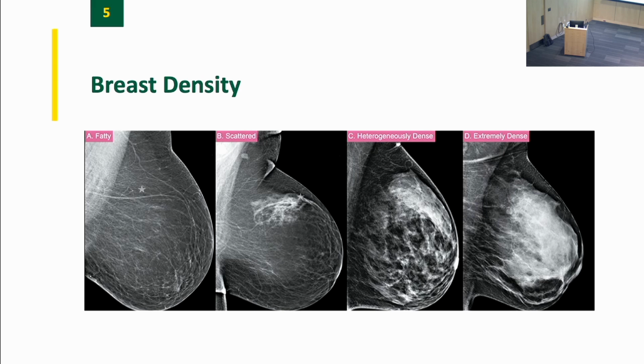There are 4 densities in X-ray typically. Air, which is the complete black around the image. The next most dense is fat, which is the black part of the breast tissue. The next density is water, which includes vessels, arteries, veins, muscle, cancers, and anything that approximates soft tissue density. And then the last one is metal or bone. You could maybe consider 5 densities.